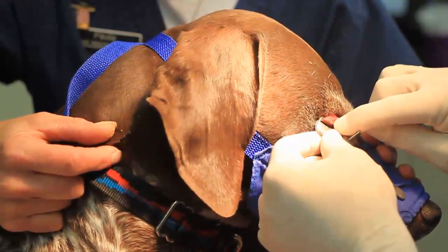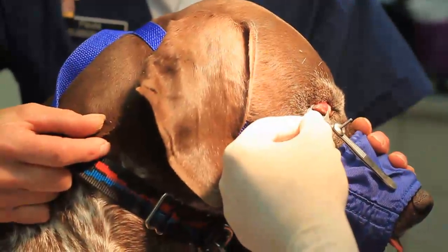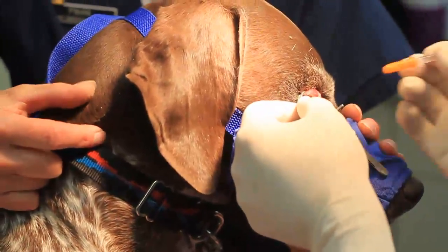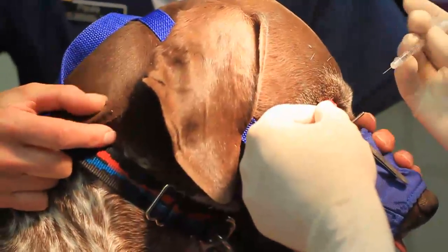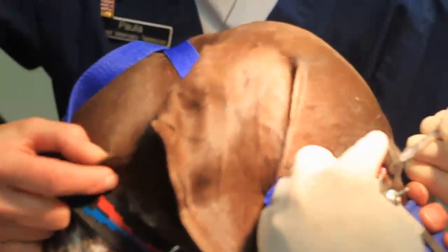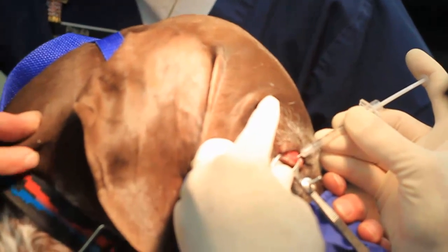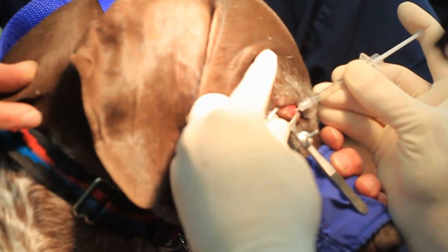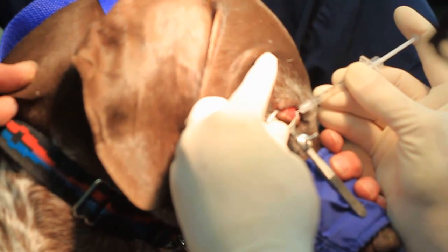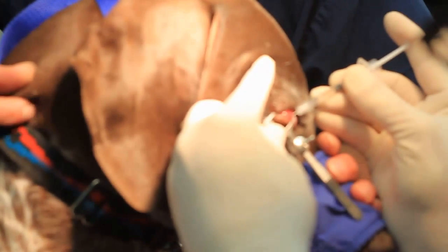You can see right there is the meibomian gland adenoma — we caught this one early before it formed a big stye. I take an insulin syringe and it takes very, very little amount of local to do this procedure. I'm just going to inject right in here, and a lot of times you'll see the lidocaine come right out of where the meibomian glands are. I can see it starting to bleb up, so I know I'm right in the gland where I need to be.